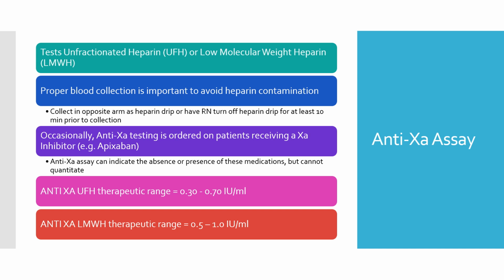testing menu. We will be moving forward and talking about some special coag testing, including our PT-PTT mixing studies, which we have briefly talked about, but really haven't dived deeper into. Once we have that lecture done, we are going to do the APTT differential test page worksheet. I'll have you guys work on those so that we can kind of determine, number one, what is a mixing study, and number two, what is a correction versus a non-correction, and number three, how do we determine which of those deficiencies may or may not be present, or are we looking at an inhibitor?